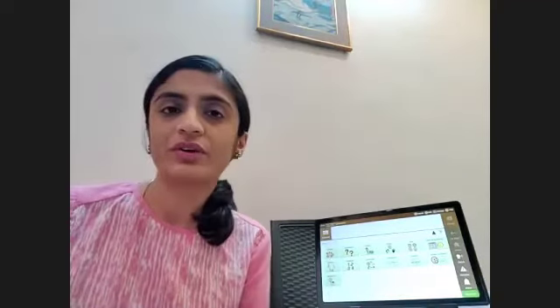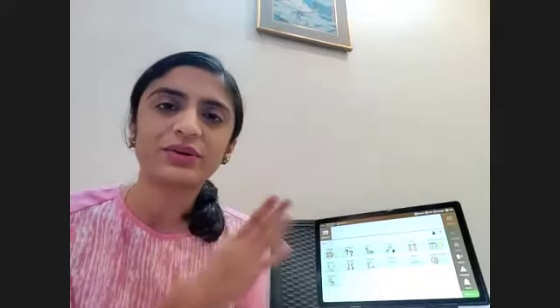Neeti says, how do we prepare the Avaz screen for a story? Maybe the first thing to do would be to figure out for yourself what word you would like to model. So for example, if you're learning to ask the question, what? Then you can go through the book yourself and decide, okay, how am I going to do this? And once you've decided that you're going to model what, then that should be there either in your advanced screen or in your core words, anywhere. So you can just prepare that.